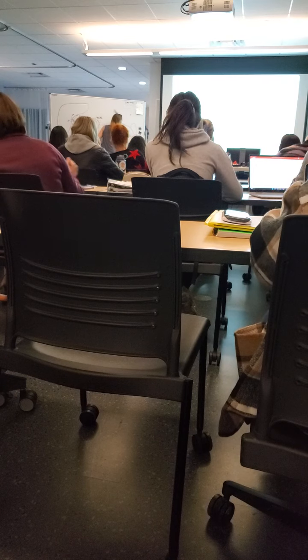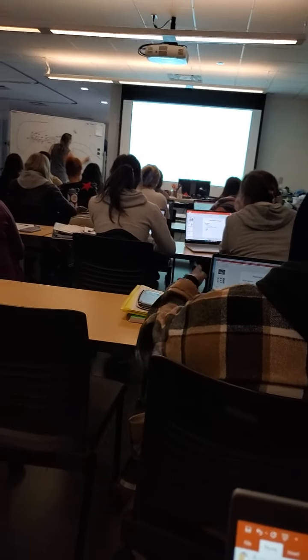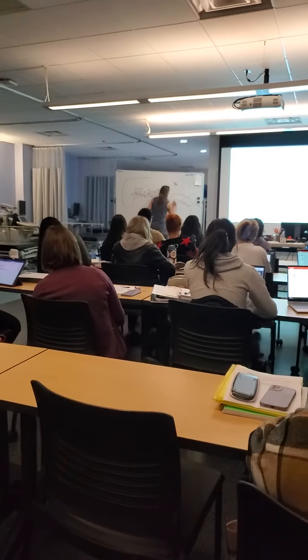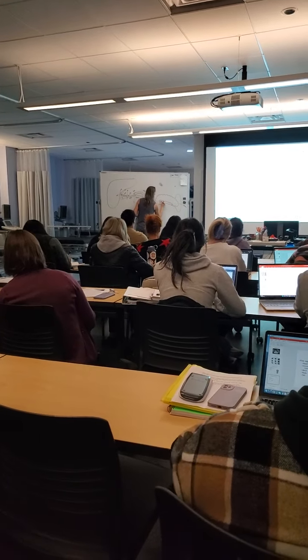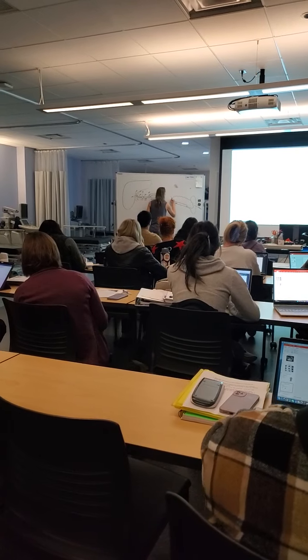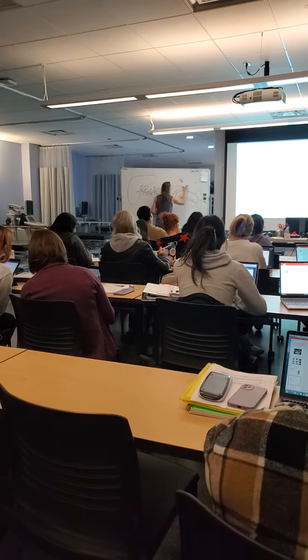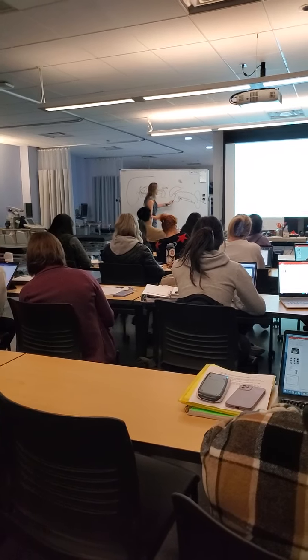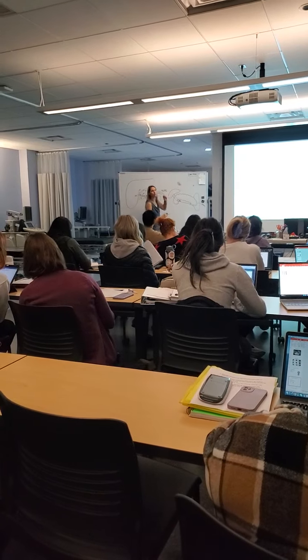And then the spleen is going to be over here. And then our main portal vein, that splenic vein, is going to be coming under here, so this is the splenic vein here, and this is going to become the main portal vein, and then it's going to go into our liver at the porta hepatis. So these guys communicate significantly. He's kind of the guy who's like, hey, spleen, give me all your blood and we'll take it into the liver.